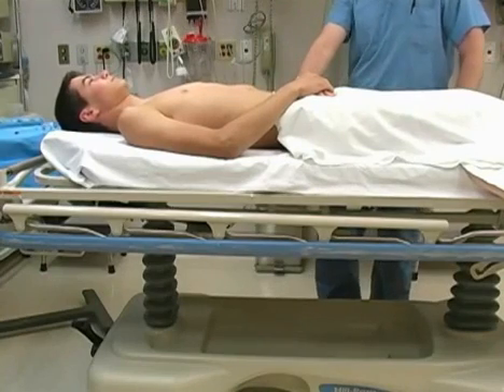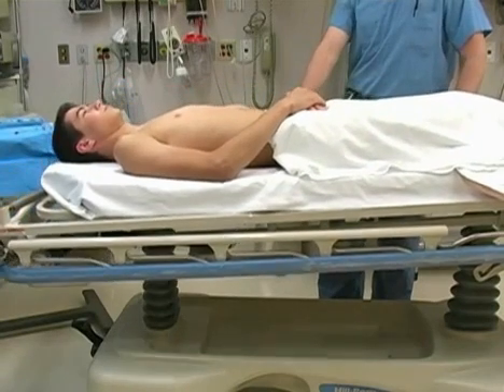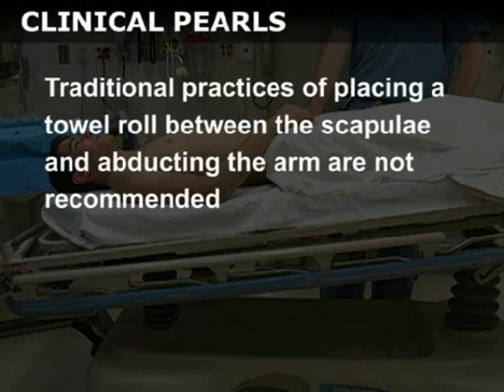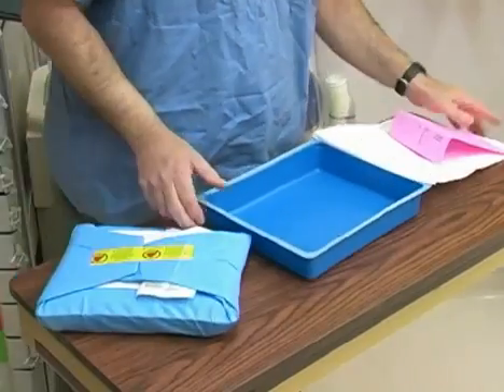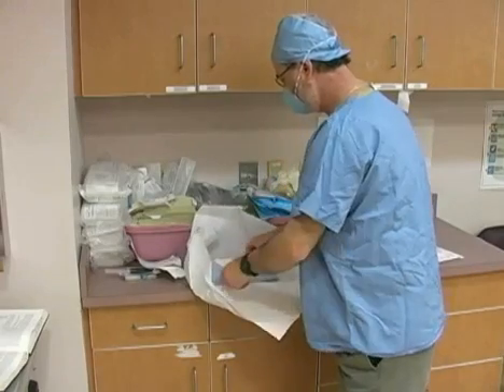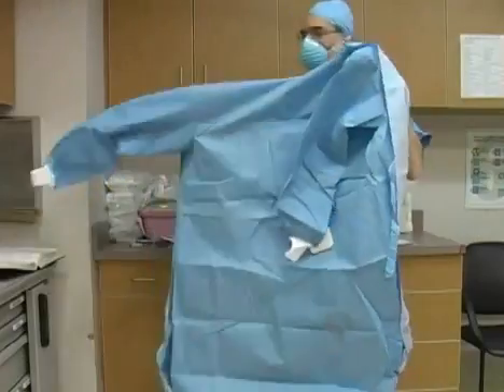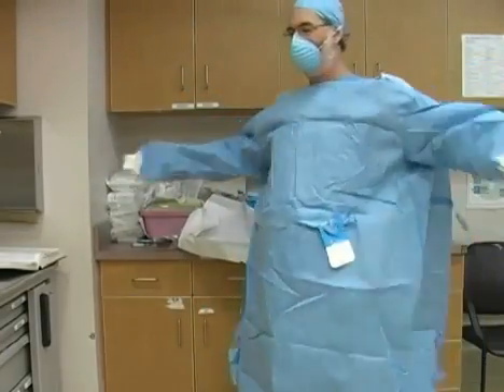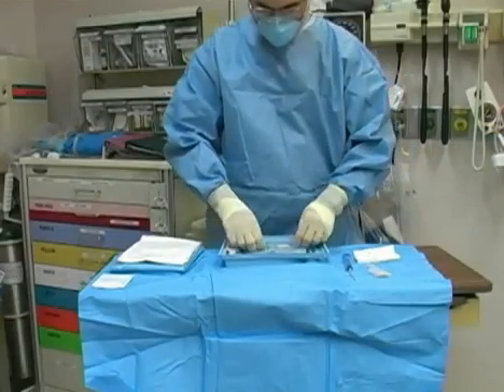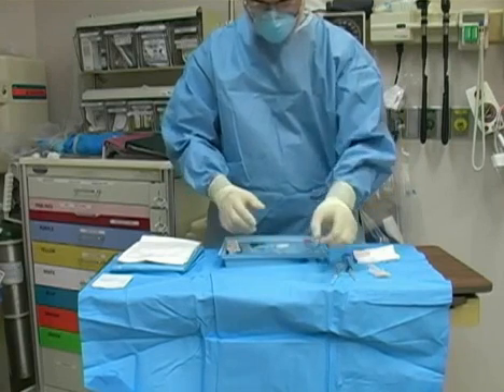Position the patient supine with the stretcher placed in 15-30 degrees of Trendelenburg. The bed should be at a sufficient height that you do not have to bend over or stretch during the procedure. Traditional practices of placing a towel roll between the scapulae and abducting the arm are not recommended. Open the central line kit on a bedside table, positioned within easy reach. Before unpacking the kit, put on a face mask, surgical cap, and a sterile gown and gloves. Next, lay out the equipment on the sterile wrapping from the kit. It is helpful to arrange the contents on the table in the order that they will be used during the procedure.